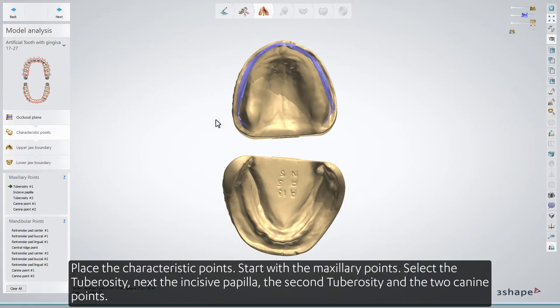Place the characteristic points. Start with the maxillary points: select the tuberosity, next the incisive papilla, the second tuberosity, and the two canine points.